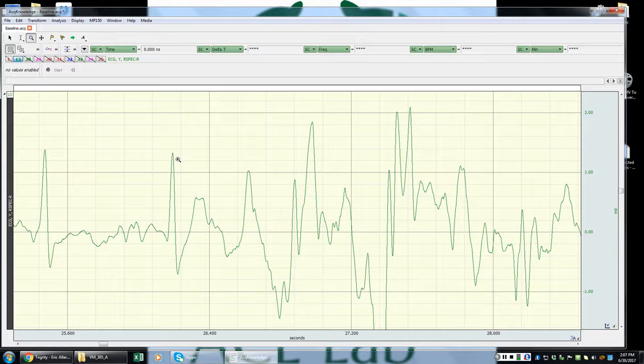Okay, so there's a little bit of flaring out towards the middle point of the wave, and it kind of comes up to a little bit of a peak. If I'm looking at the shape, there's a few of these shapes that I can probably already right off the bat say are not going to be the same shape as these two R peaks. For instance, this one right here: the top looks to be a little bit too broad and wide.